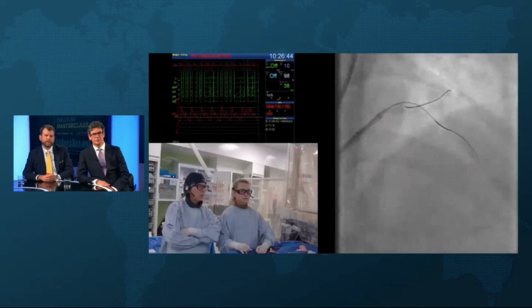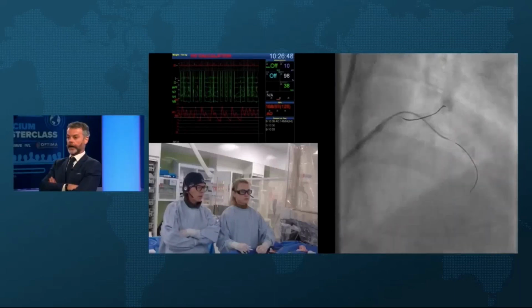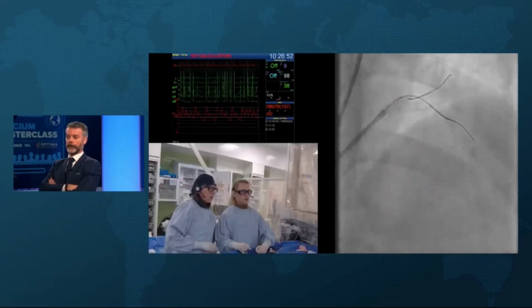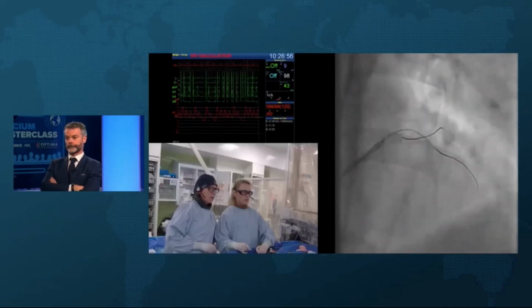A really big septal, and actually, as Margaret said, there's a very high-grade lesion immediately after the aneurysm. So it's trying to localize on that. It's pretty difficult with the wire floating about in it. Yeah, it can be a real challenge.